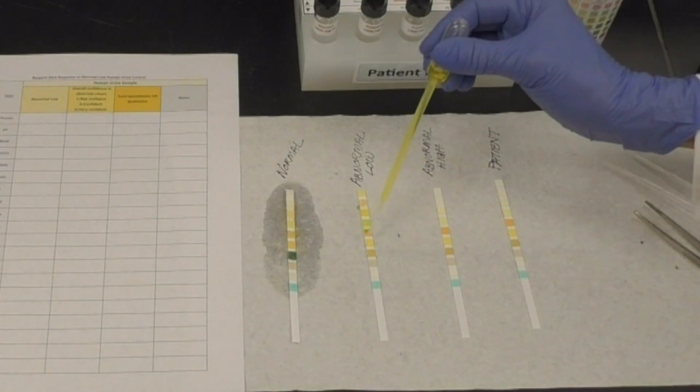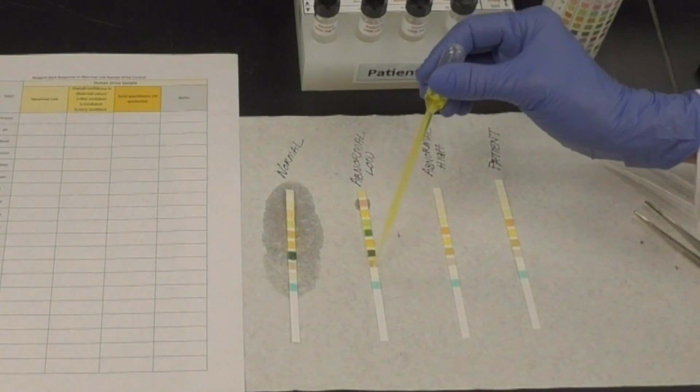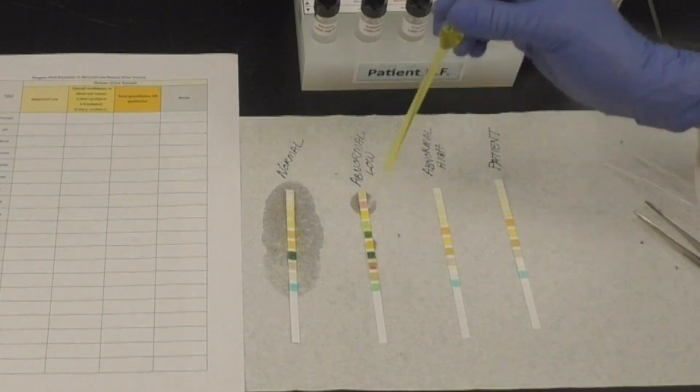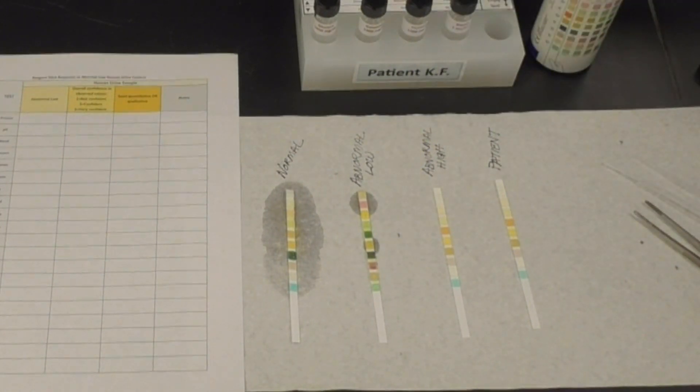To run the sample, use a fresh transfer pipette. Place one drop on a pad. If you are comfortable, you can try spotting all the pads on a strip at once. Otherwise, spot just the test you are interested in. Read the results at the appropriate times indicated on the charts provided.